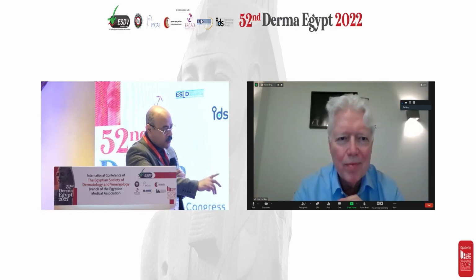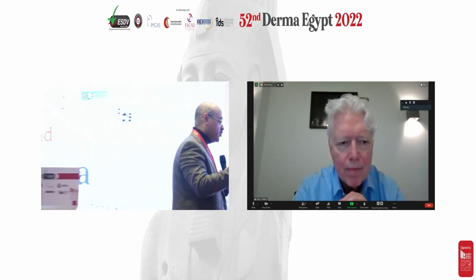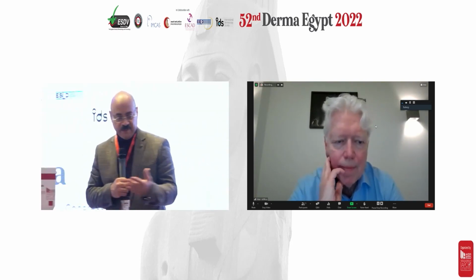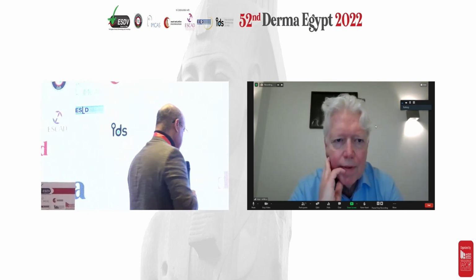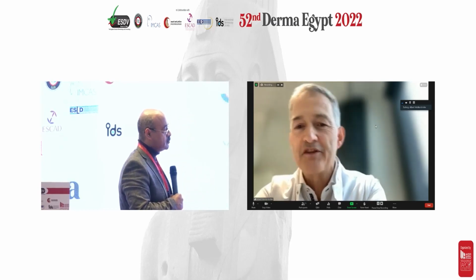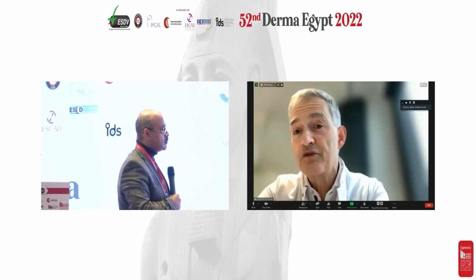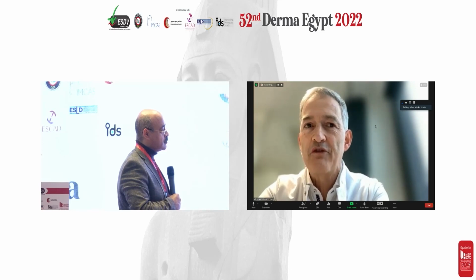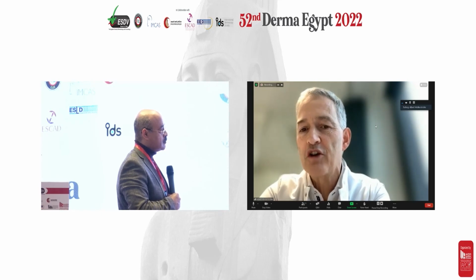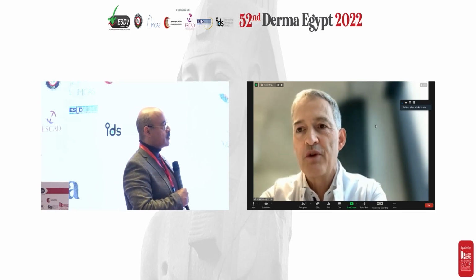Albert, as you are still here, what about the old scars? If you have a patient with an old scar, whether acne scars or fibrotic scars, what type of lasers do you use? Ablative, fractional, non-ablative fractional, resurfacing? What is the best tool? In fact, I use quite a lot of different types of lasers. The fractional CO2 laser, I use pulse dye laser. I also use Q-switch lasers because sometimes the scars are very hyperpigmented. Although that also improves with a fractional laser, often not enough. And you can combine all those devices in the same session to improve the outcomes.